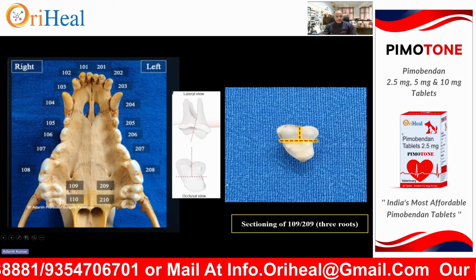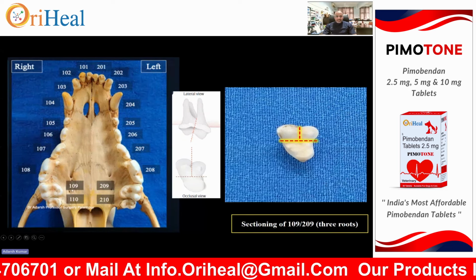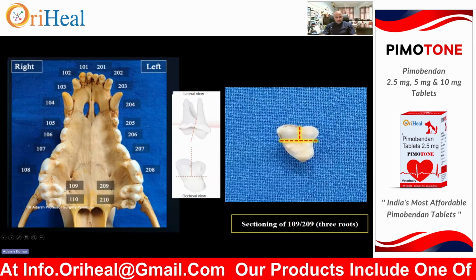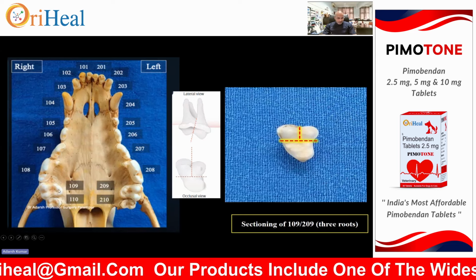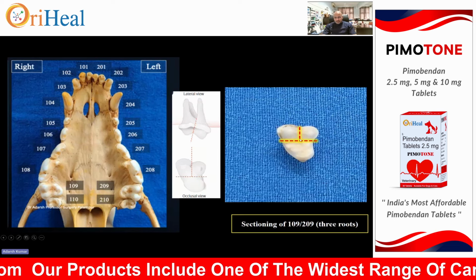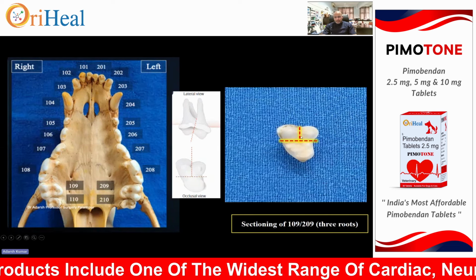Now, this is sectioning of the three roots. That is 109 and 209 here. The molars here, look at the shape here. One root, two root, and three root. So you give an incision like this. First of all, separate the two roots, right?